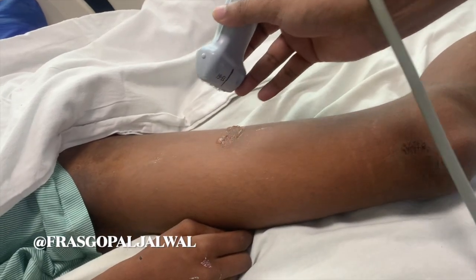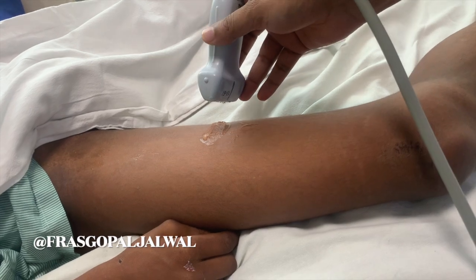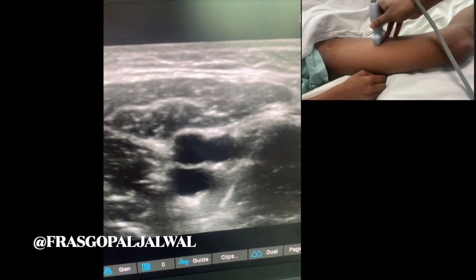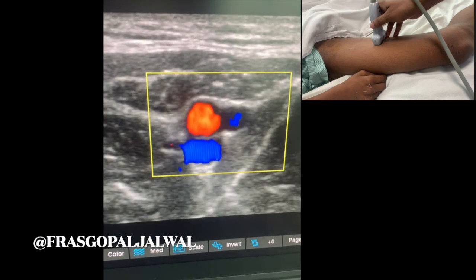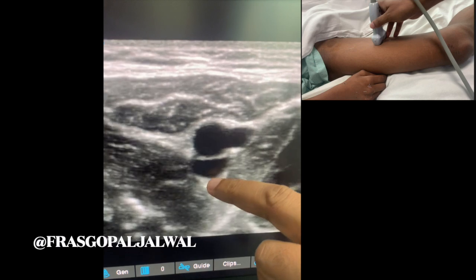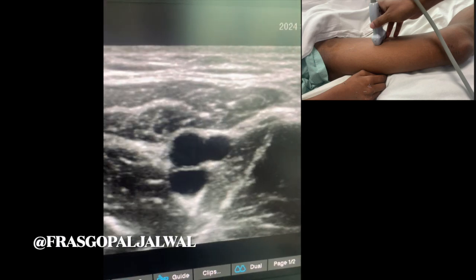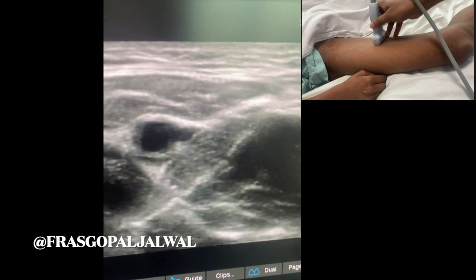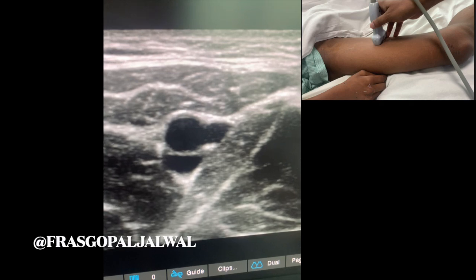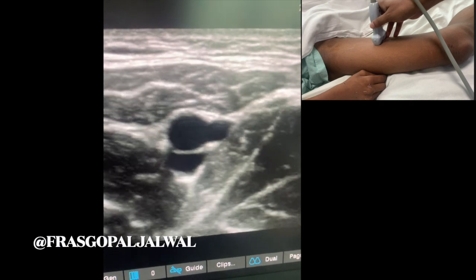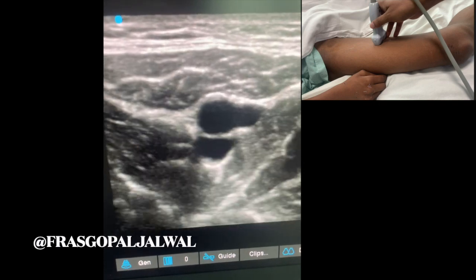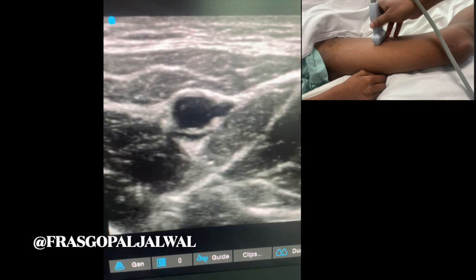Next, I am going to scan over the medial aspect of the mid-thigh. I am applying color Doppler so that you can see. This is the femoral artery and this is the femoral vein, just posterior to the femoral artery. Again, I am going to compress — when I apply pressure over the probe, the femoral vein compresses and the anterior and posterior walls touch each other. This indicates there is no thrombus inside the femoral vein.